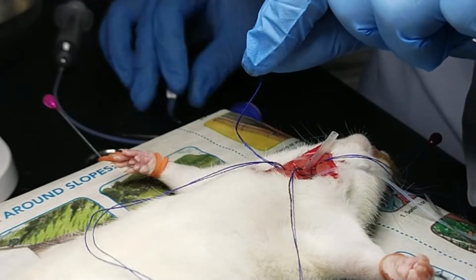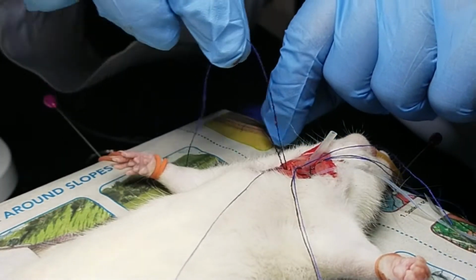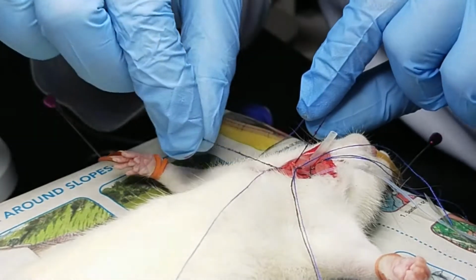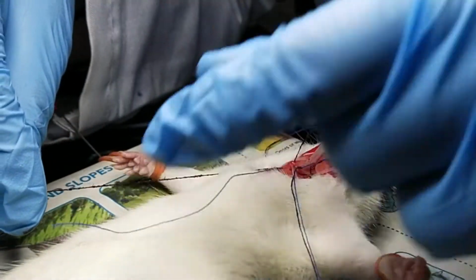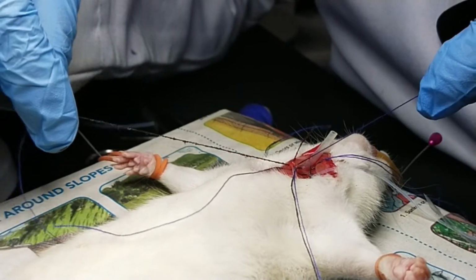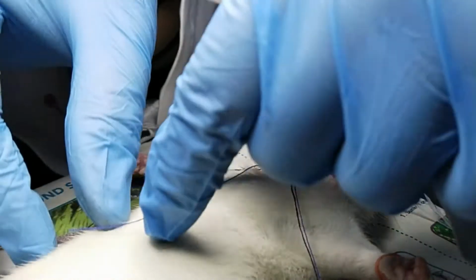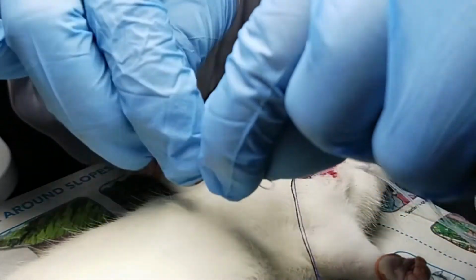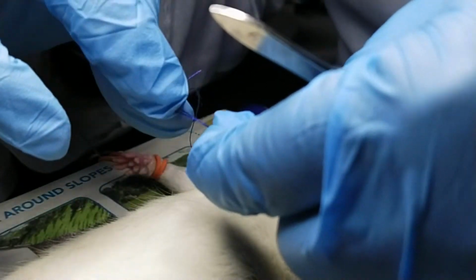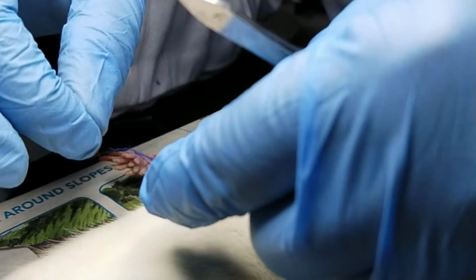And then cut into it. I'm going to make a loop here so that it is easier to tie later.